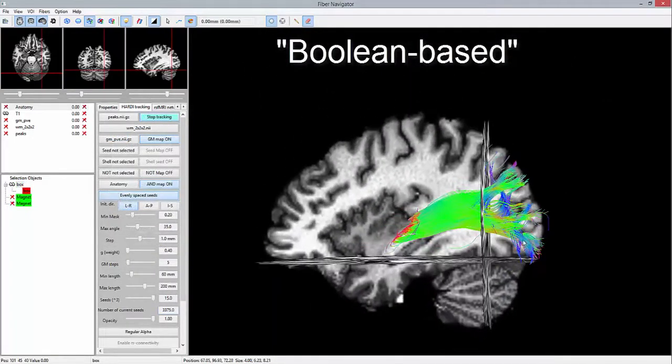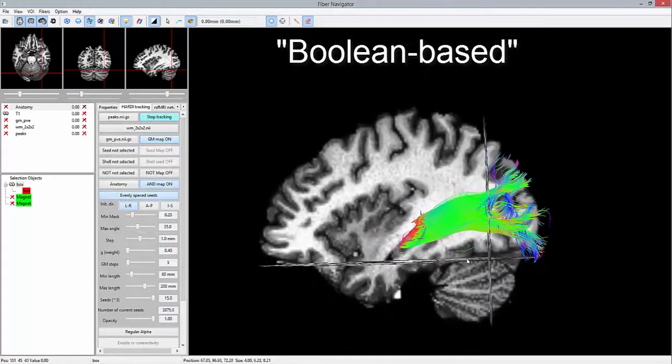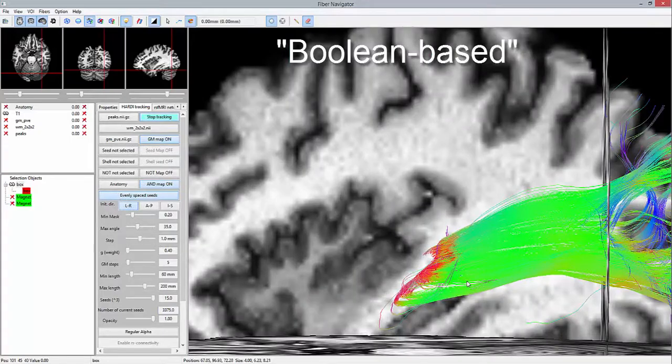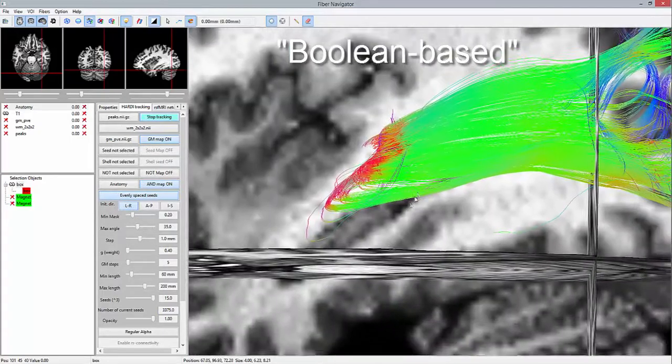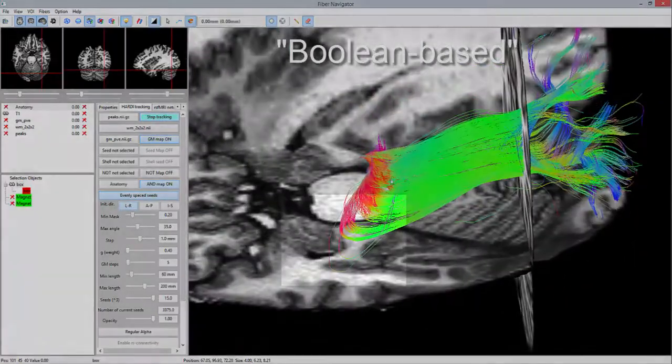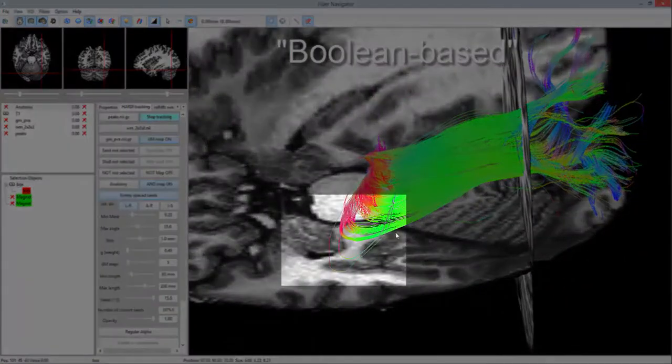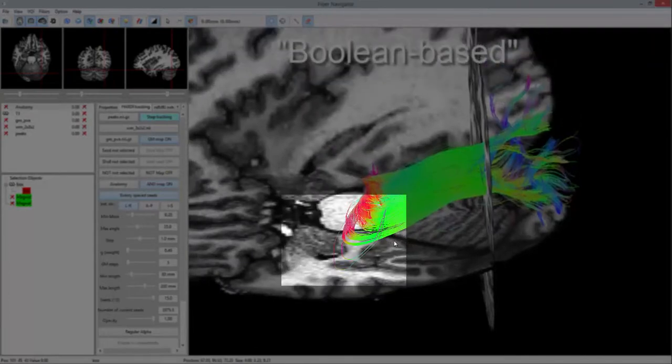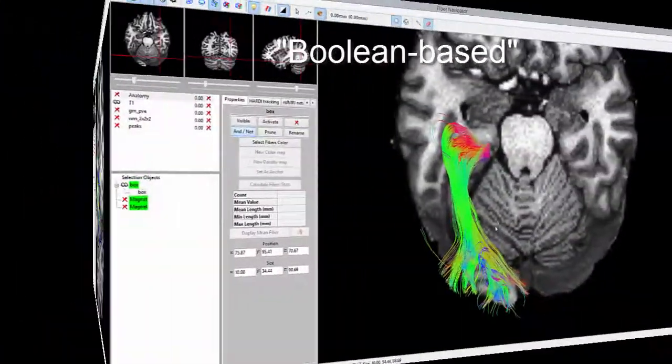In this video, this reconstruction is referred to as the Boolean-based method, as we retrieve a fair anterior extent of Mayer's loop, but as we will see, there is still room for improvement.